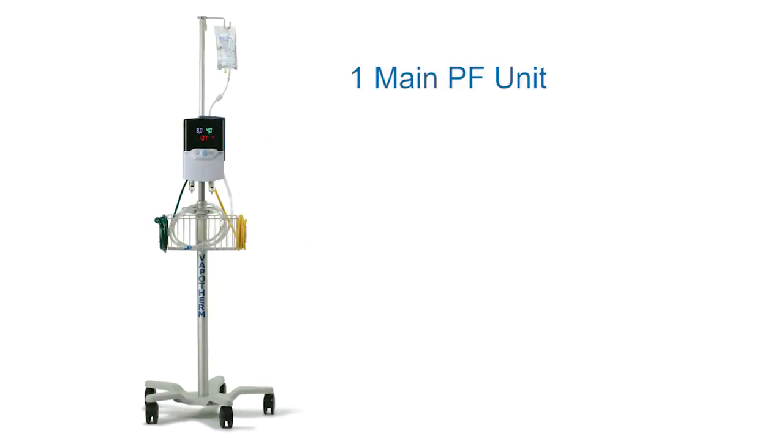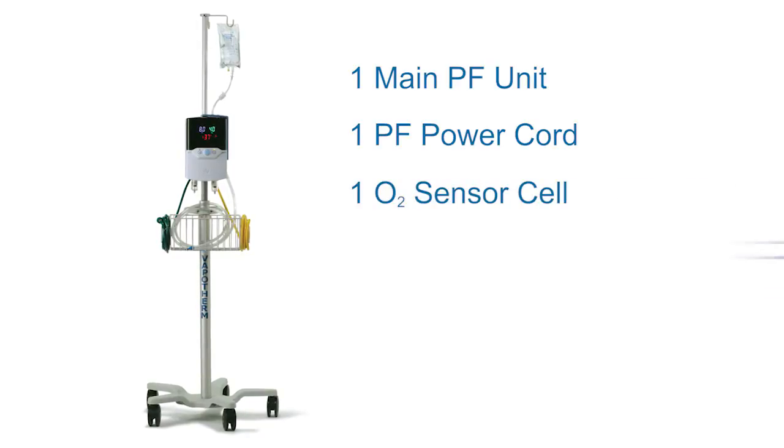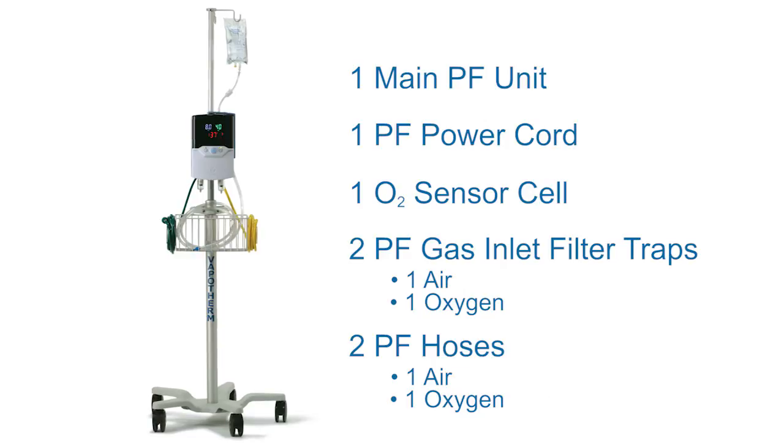Each Precision Flow comes with one main Precision Flow unit, one power cord, one O2 sensor cell, two Precision Flow inlet filter traps — one for air and one for oxygen — and finally two Precision Flow hoses, one for air and one for oxygen.